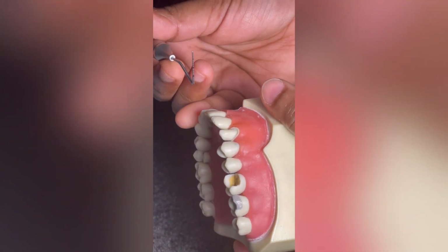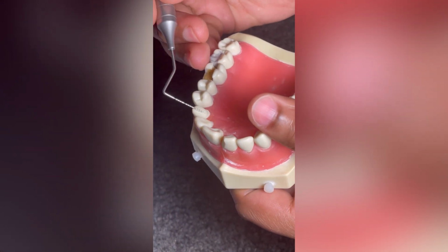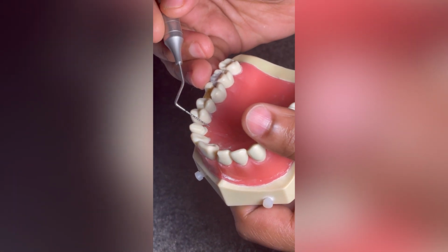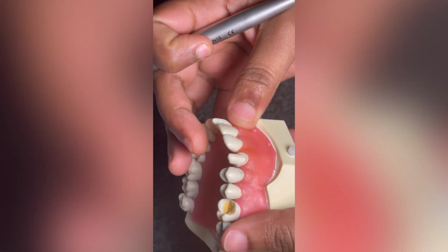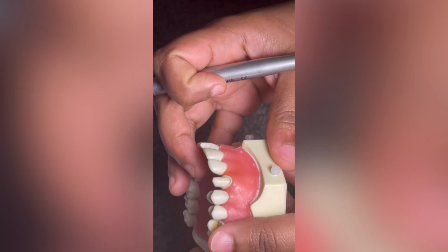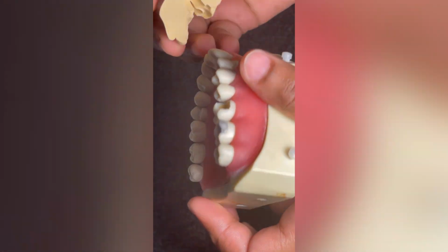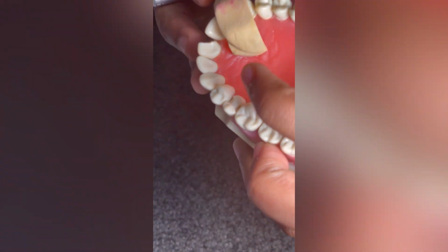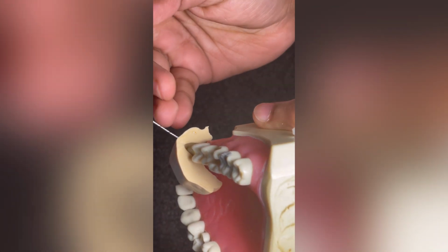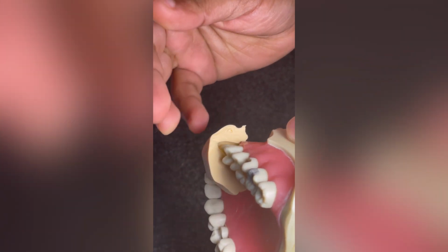Reduction, uniform reduction reflecting anatomy. I would say the cingulum maybe not quite, but generally maintenance of occlusal anatomy. And occlusal reduction allowing full occlusal ceramic coverage. Let's just try this putty here, it's not quite good, but anyway.